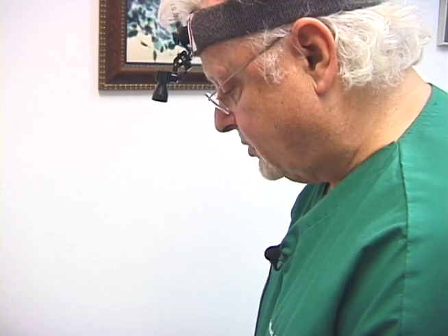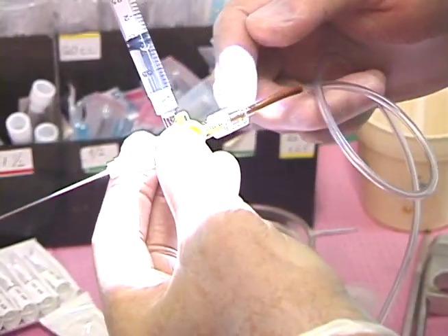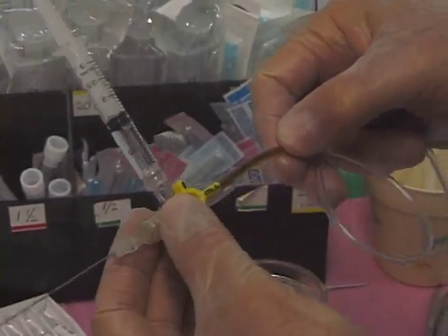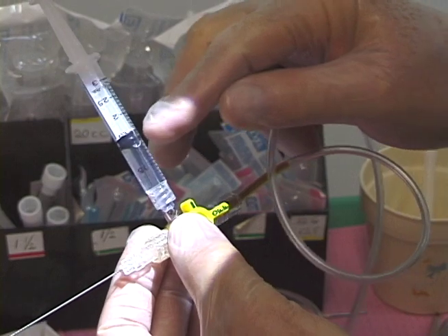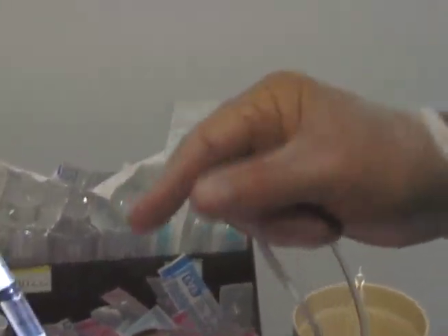This cyst that we tried to put alcohol in — the cyst fluid was very thick, so we were only able to get a small amount of fluid out. We had to change this into a two-step procedure. We put a little bit of ethanol today and next week she'll come back; that liquid will liquefy the cyst and we'll be able to drain the rest of it and put the regular amount of alcohol. It's called a two-step and it's used when people have thick cystic fluid.